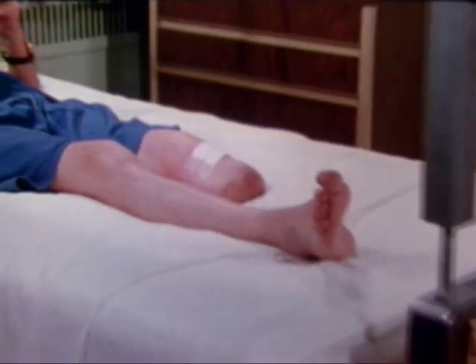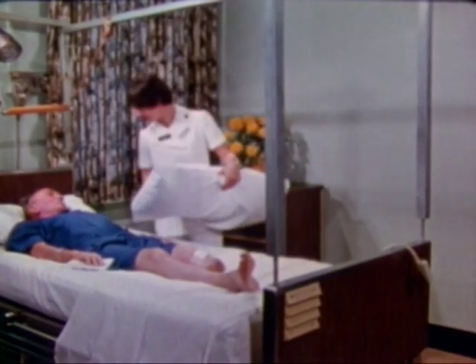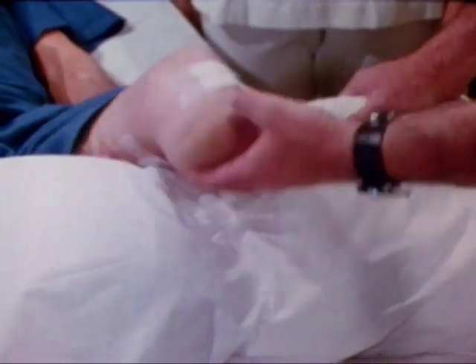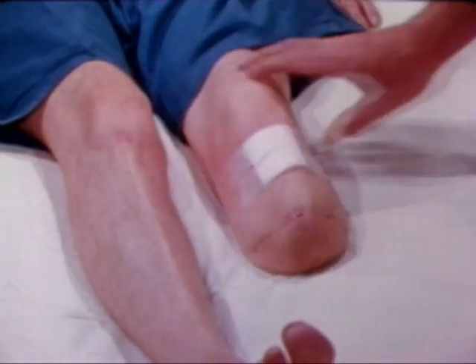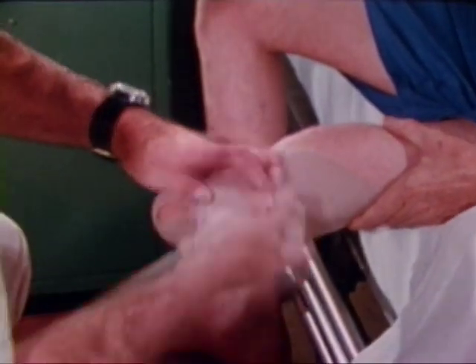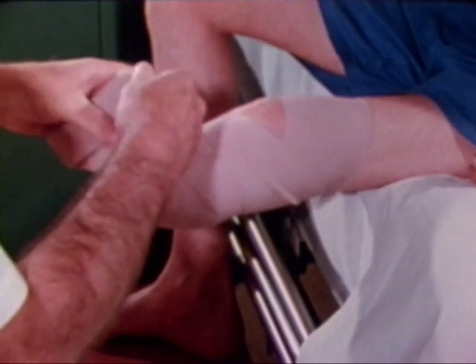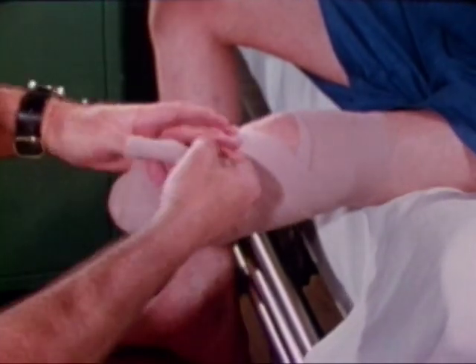There are some significant differences in the pre-prosthetic care of the below-knee amputee. In a misguided effort to make the patient more comfortable, well-meaning others will occasionally malposition the amputee. The optimum bed position for the BK patient is flat on the back with legs together but without support under hip or knee. The highlights of bandaging the BK stump include: utilize spiral rather than circular turns, again exerting slightly more pressure distally. Secure the bandage above the knee and enclose the femoral condyles as they are contained within the prosthesis. Leave the patella exposed to allow knee motion.